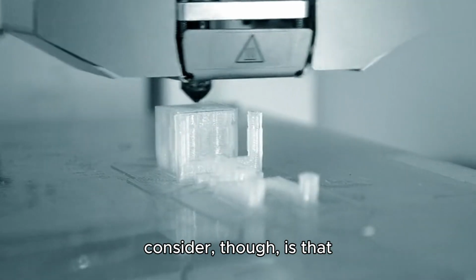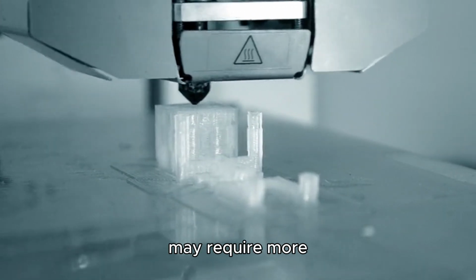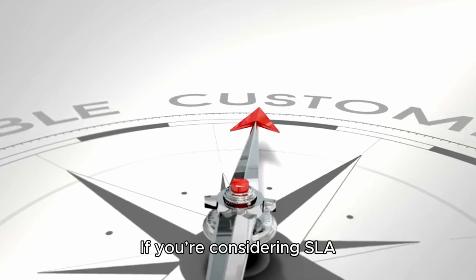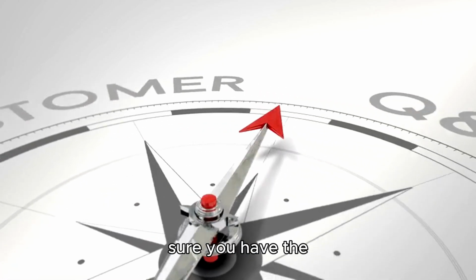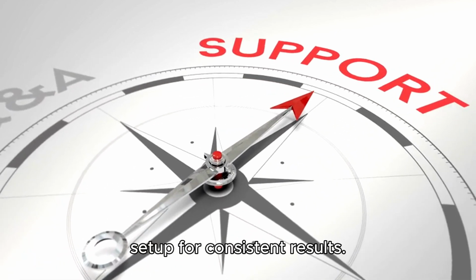One thing to consider, though, is that SLA printers can have a higher initial cost and may require more maintenance to keep the light source calibrated. If you're considering SLA for your practice, make sure you have the appropriate support and setup for consistent results.